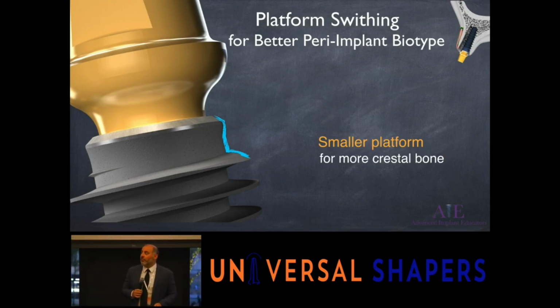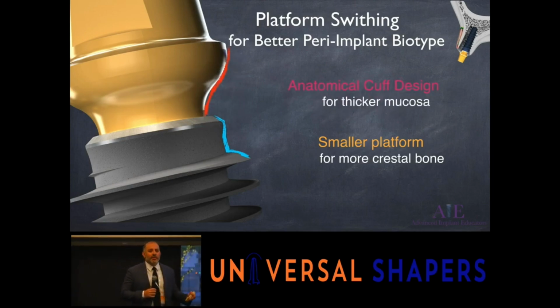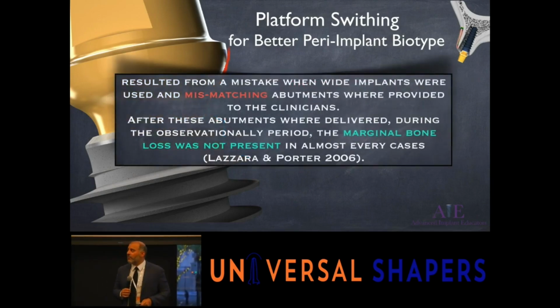Then, from the platform going up towards the abutment, we have our second shift, and that's what we know as the platform switching or platform shifting. And we like to try to make these anatomically designed, to have an S-line type of shape, to have more curvature, to allow for soft tissue to fill in. And this study was actually from Lazzara and Porter in 2006 out of UCLA.